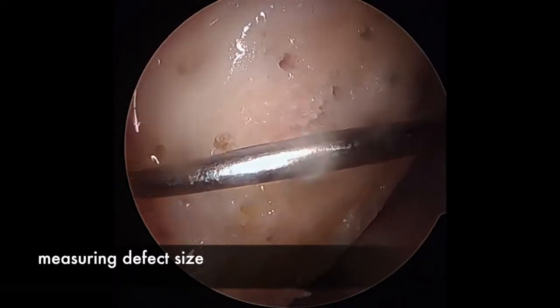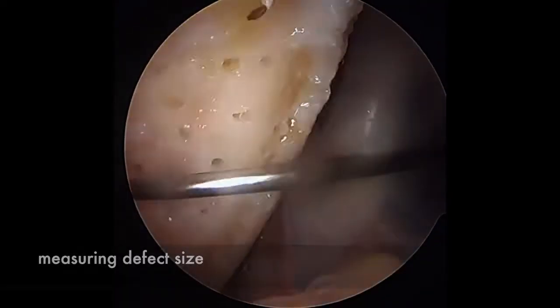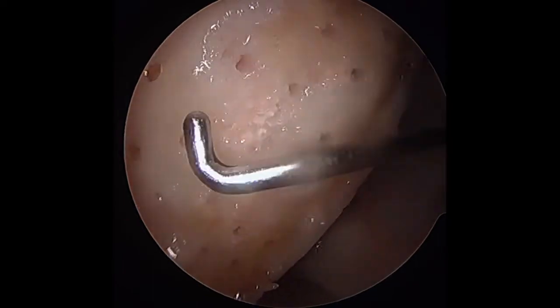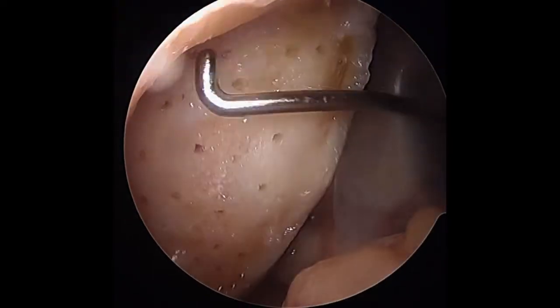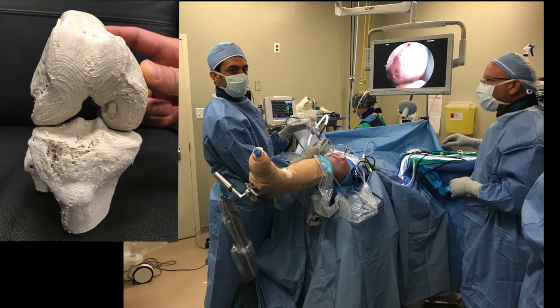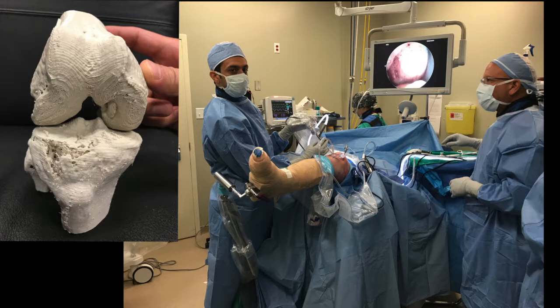The defect size is measured using a probe and found to be 20 by 30 by 6 millimeters. This is the view of the orientation of the patient's right knee in preparation for CARGEL application.